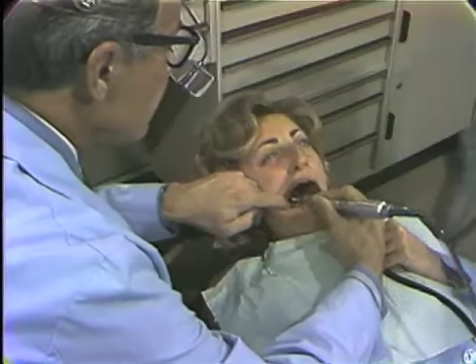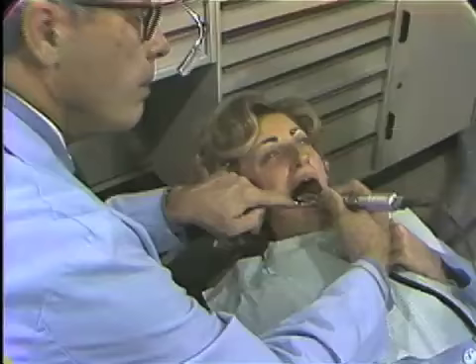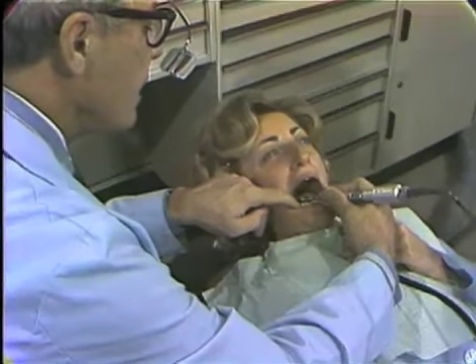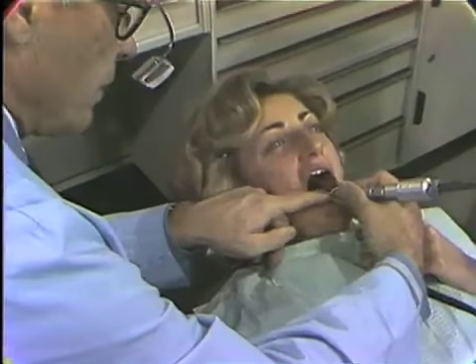It can go way back to the second molar. You can still pull the mouth back and look in and see between the tooth and the disc. The lingual is very simple on the lower, and again it shows the importance of the long mandrel. The long mandrel to get over these teeth.